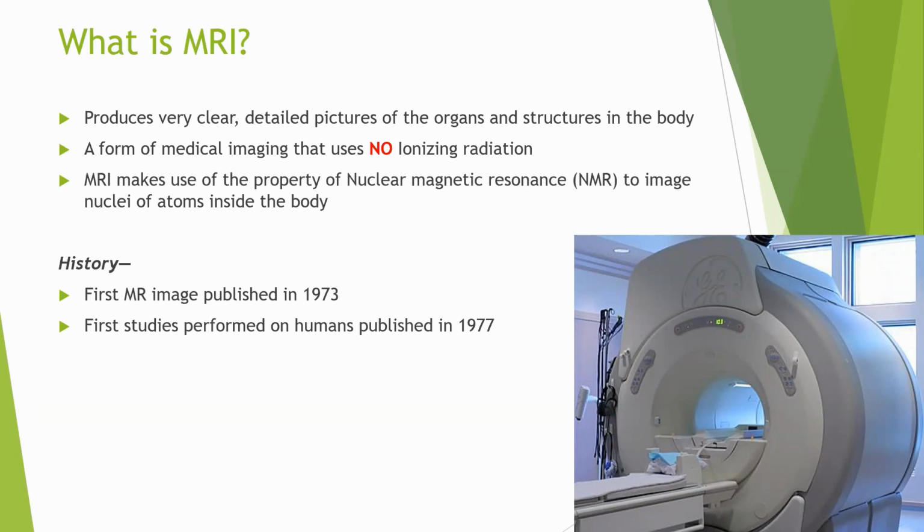What is very, very important to know, and I have bolded in red, is that it's not an ionizing radiation like X-ray or CT scan. So that's a great thing. Essentially you can ask for repeated MR scans within 1 calendar year from the first MRI that the individual has taken. You don't need to worry about radiation, because it has no ionizing radiation. What it uses is nothing but magnetic resonance. It's the nuclear magnetic resonance that takes place, that the scanner takes in.